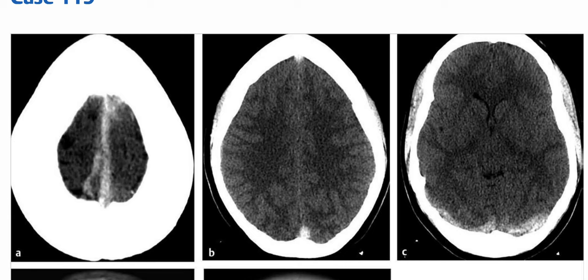Case of a 19-year-old woman presenting with persistent and worsening headaches. These are the axial sequential CT scans and the unenhanced CT scan images here. So they are showing that there is hyperattenuation involving the superior sagittal sinus, the cortical veins along the cranial vertex, and the transverse sinuses.